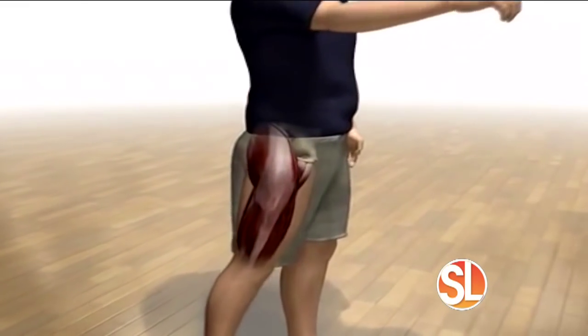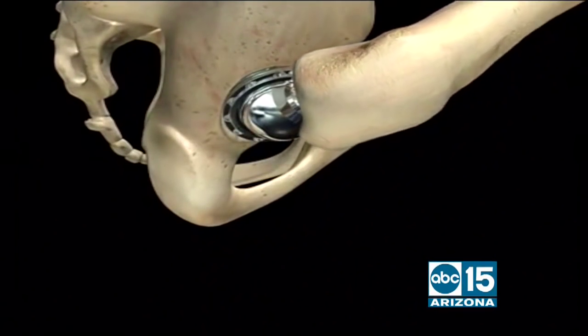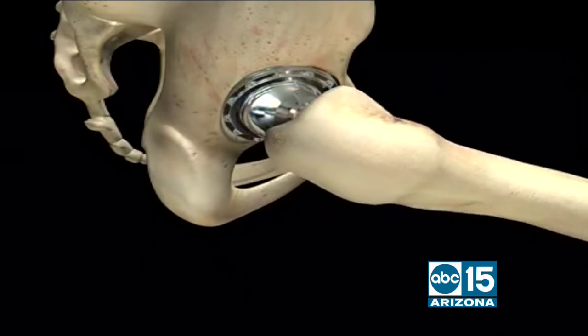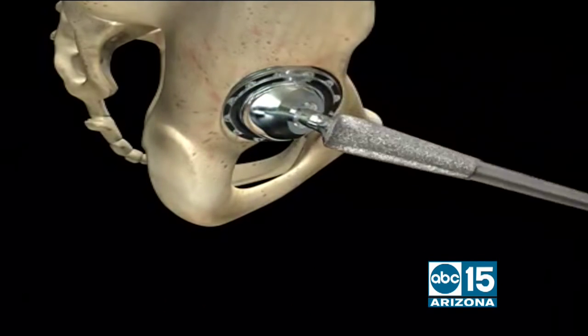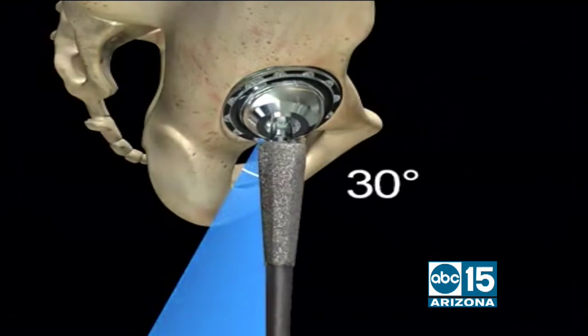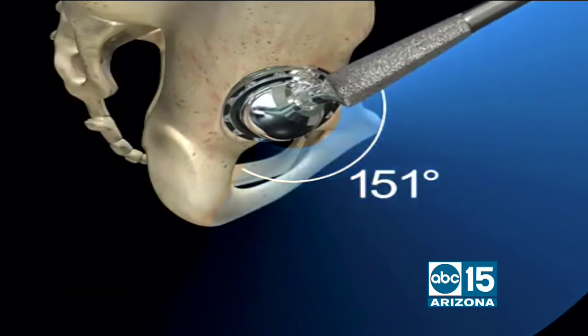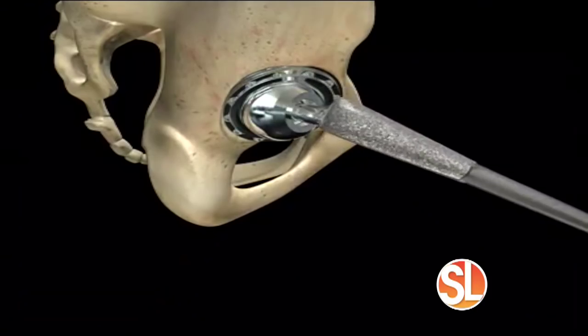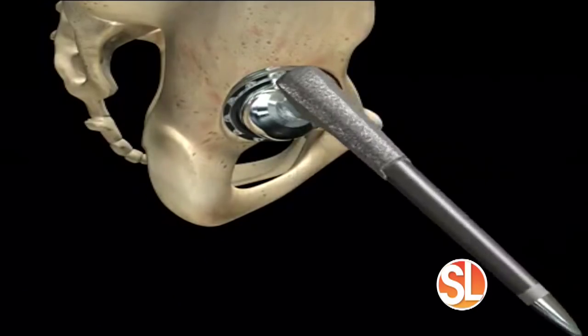Looking at the post-operative animation, not only is recovery time less, but the range of motion for the patient is even better. Because we're not cutting any of the back muscles, patients are able to regain their natural range of motion, since they're using muscles that were not injured during the surgery.